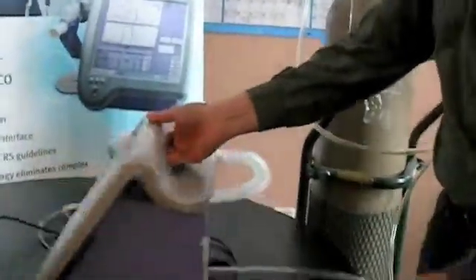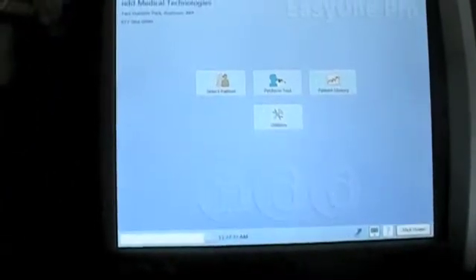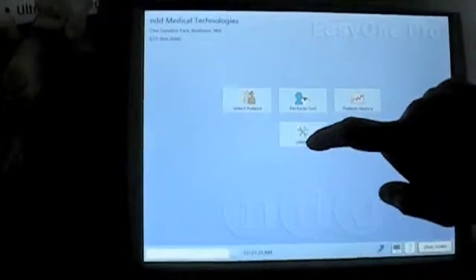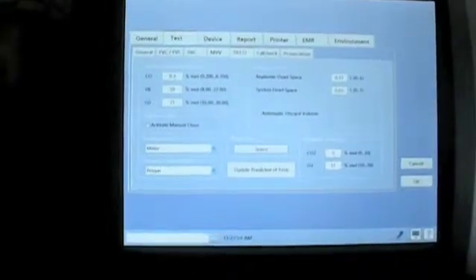Next, you want to make sure that you set the actual DLCO gas values to the appropriate settings. To do this, go to Utilities, Configuration, then select Test, and of course DLCO. And here's where the gas concentration test gas values are that you would set.